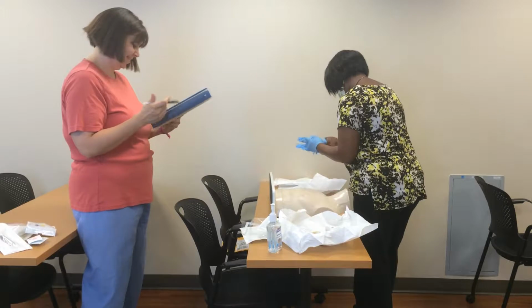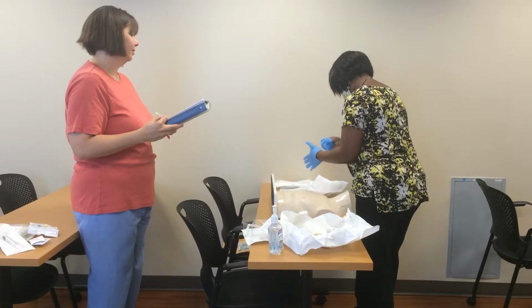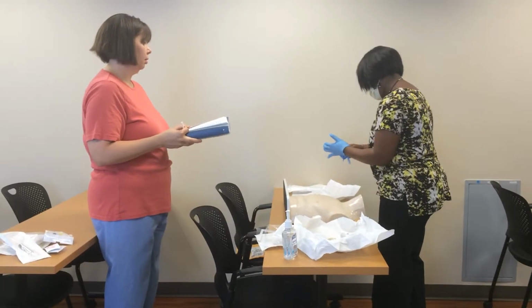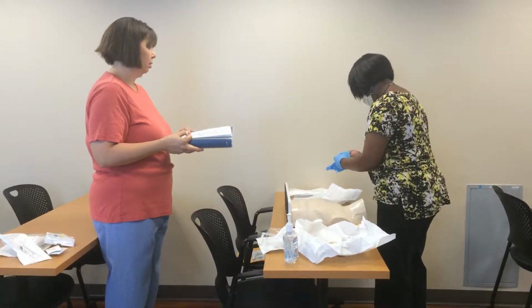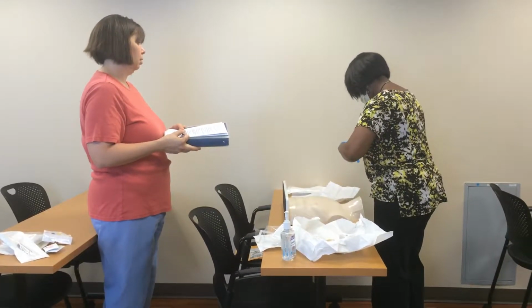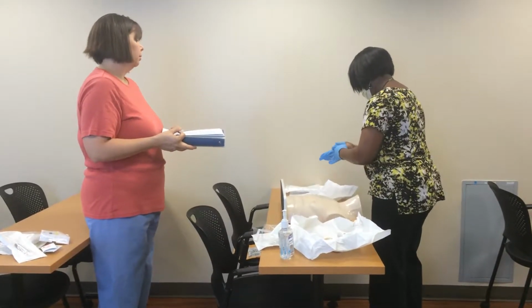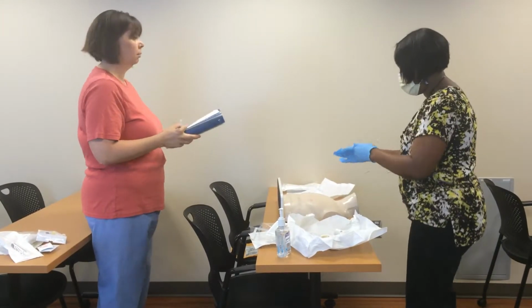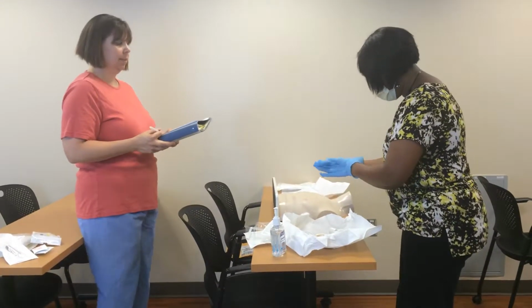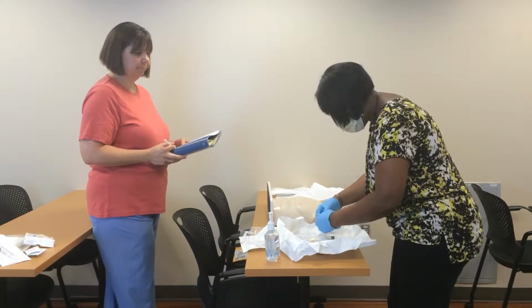Started this. Almost done. Put in the cap here.